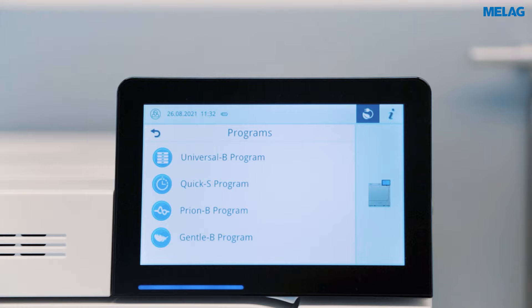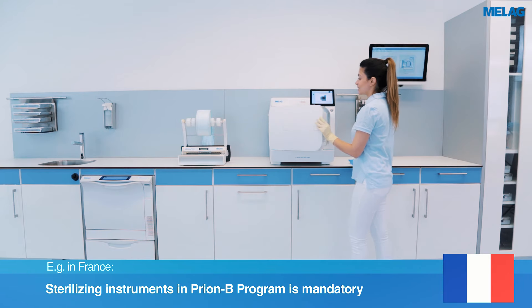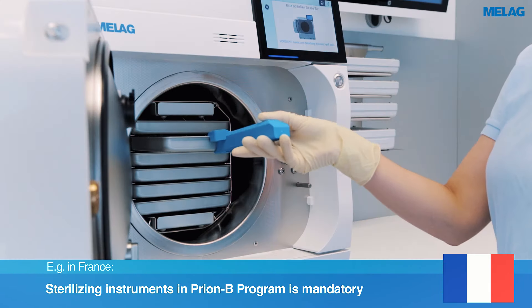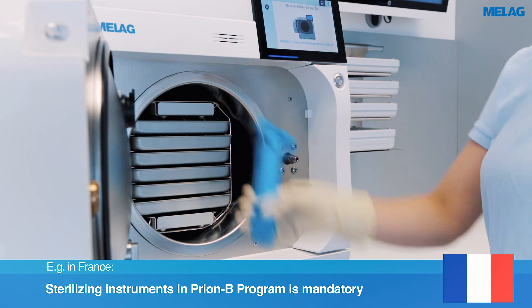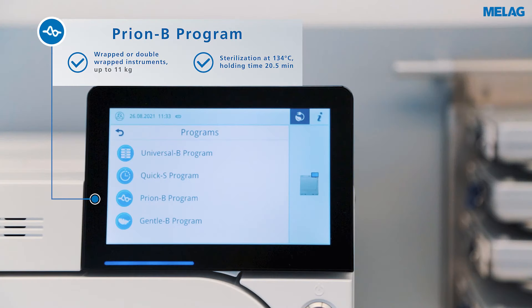In addition to the programs presented, the Prion B program has a special position. In the case of national regulations or a risk of infection by pathologically modified proteins, the Prion B program is supposed to be used.